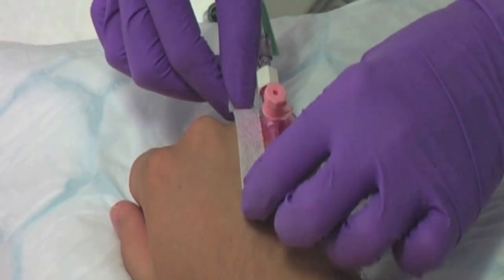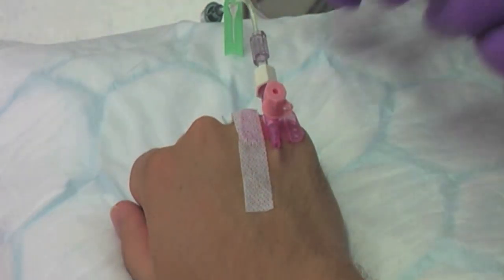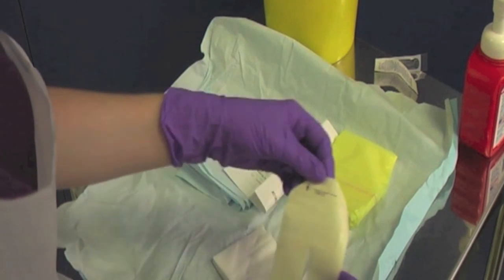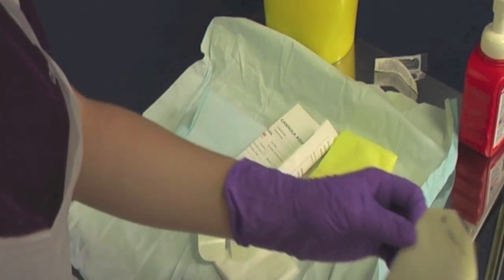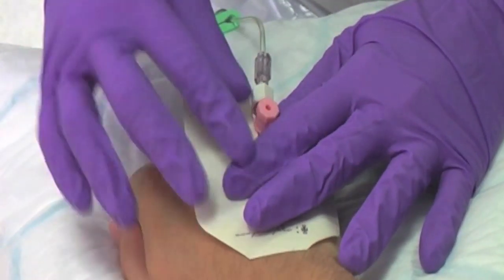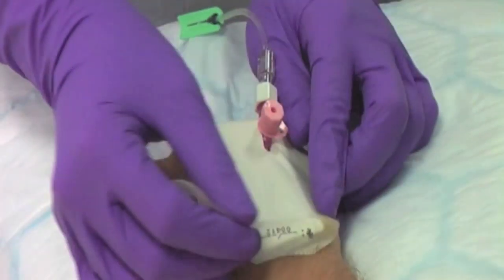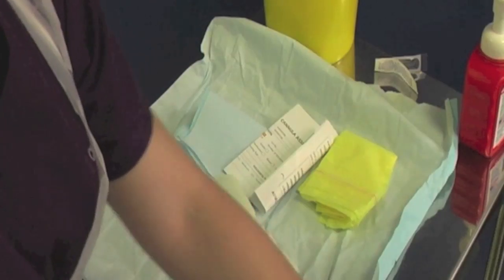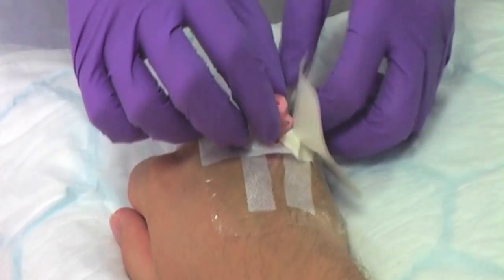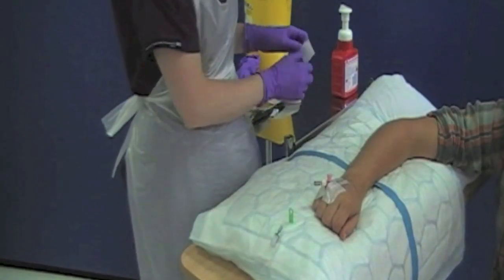Start by removing the strips and place them on the wings of the cannula. Peel off the main dressing and wrap around the cannula as shown here. Remove the backing, saving it as you will require the date sticker. Before you flush the cannula, you will need to decontaminate the bionector with a chlorhexidine wipe.